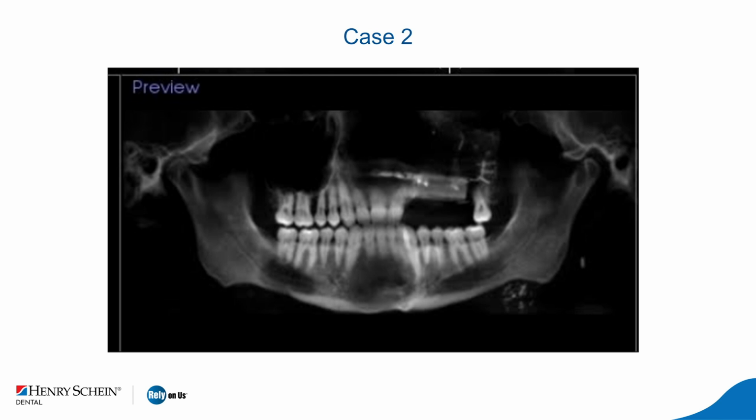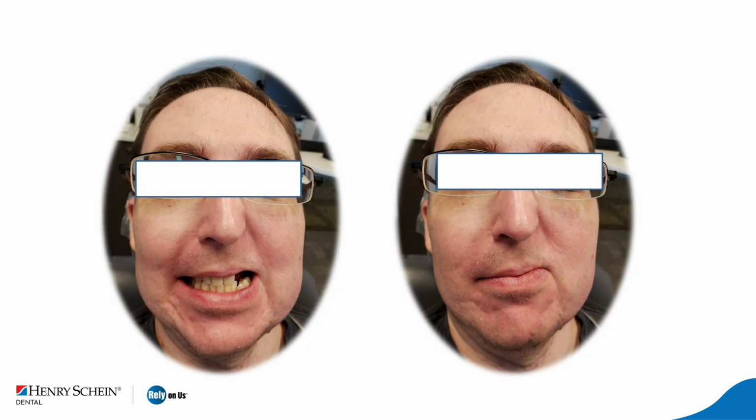And that is the bone graft that was made to reconstruct the alveolar process in that case. And you can see here that the patient, after the resection, demonstrates loss of support in the mid-face area. He also had to have a surgery to rebuild the floor of his orbit, and he lost many teeth. So the first time that I saw him, that's the first thing he told me. I never had a decay, went to the dentist twice a year all my life, and I lost all my left teeth to cancer. So those are very easy to miss.